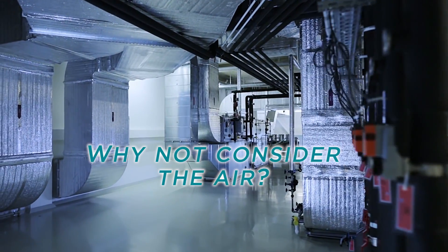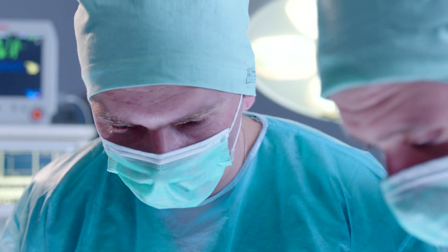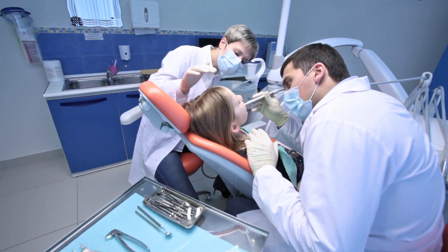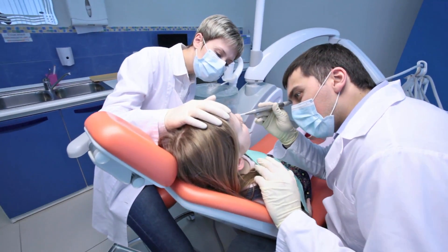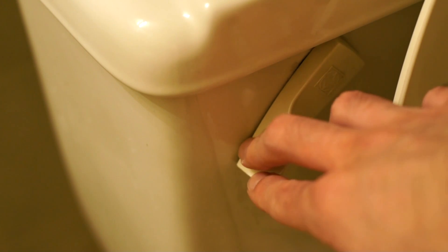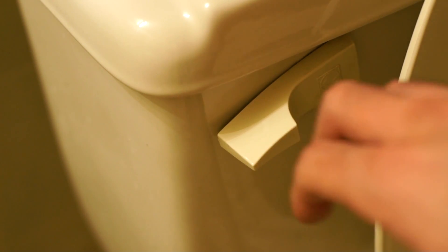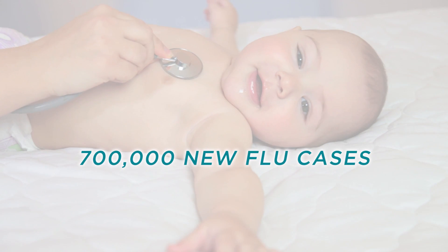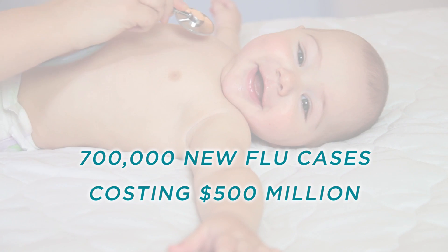Why not consider the air? Doctors wear masks during surgery. Dental hygienists wear them during routine procedures. There is risk of spreading C. diff from simply flushing a toilet. And well-child visits account for 700,000 new cases of the flu each year, costing 500 million dollars.